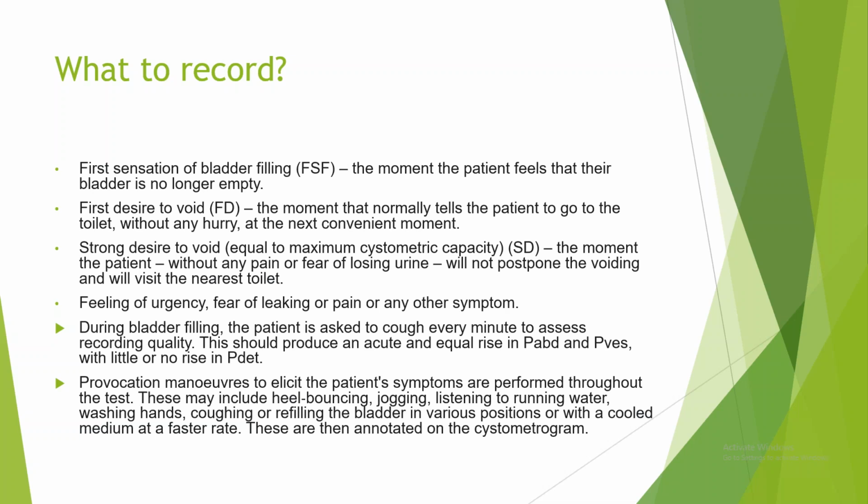So it should produce an acute and equal rise in abdominal pressure as well as bladder pressure, but no or very little rise in the detrusor pressure. This means that your machine is recording correctly. So there will be no artifacts. So the patient is asked to cough every now and then, like every 1 minute or 2 minutes.